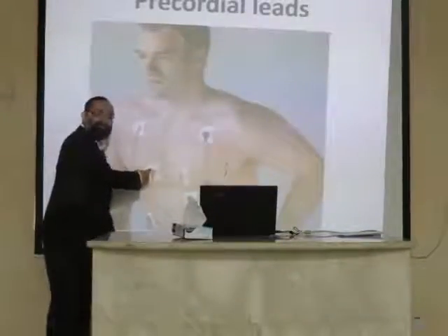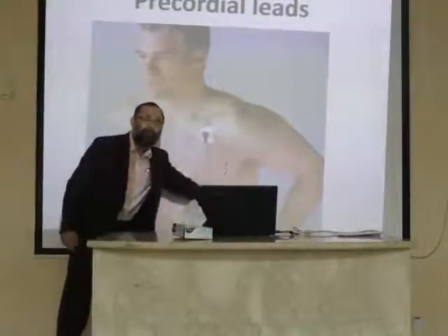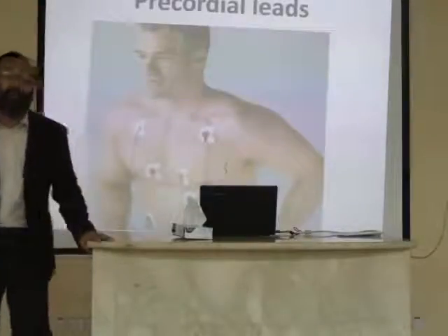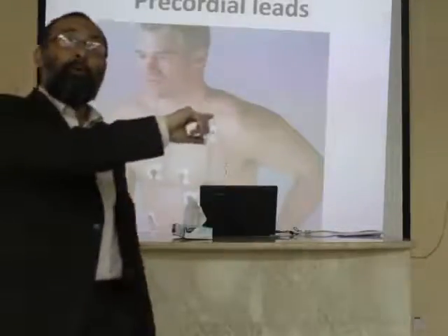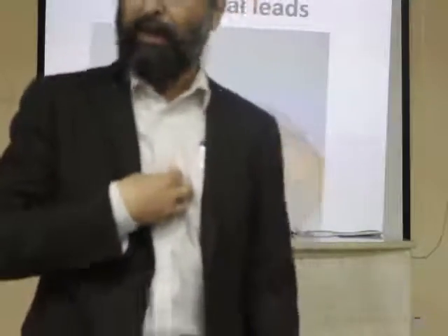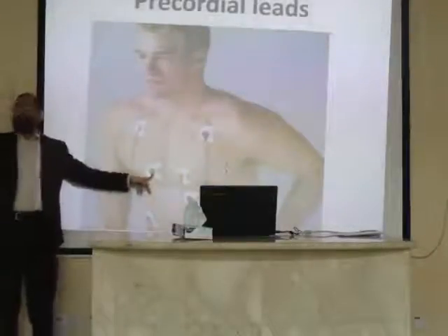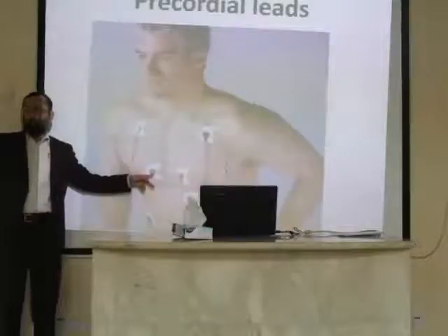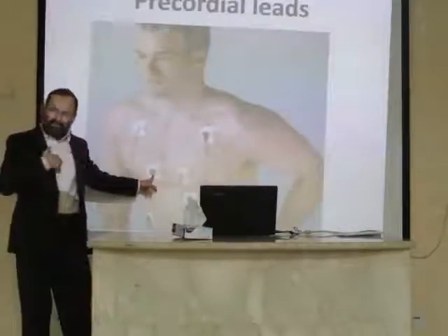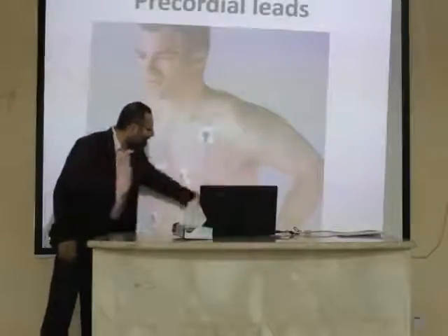This one is positive. This one is positive. This one is positive. This one is positive. At 6 different positions, you have placed 6 positive electrodes. And what is the other electrode? Yes, it is 0 inside the qalb, in the center of the heart. Okay, that's 0. So again, you are making a system between positive and 0. This is a unipolar system. All right. This attachment is called V1. Sometimes C1, sometimes V1, chest 1, or we call it V1, V2, V3, V4, V5, and V6.